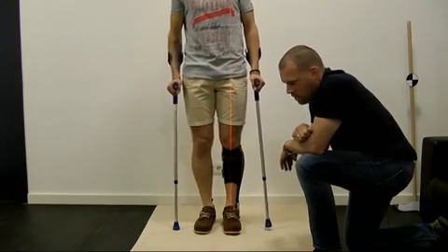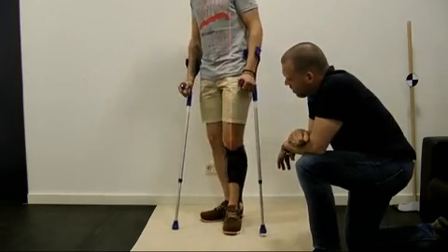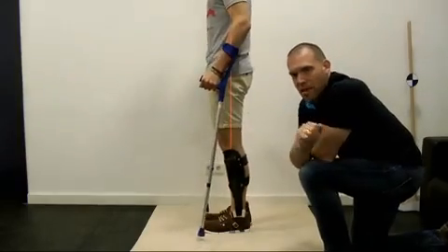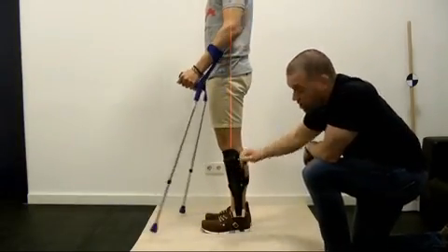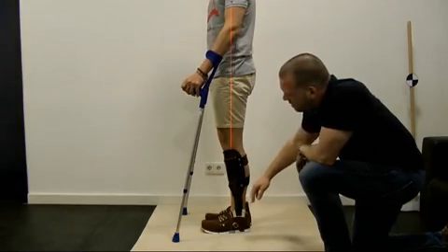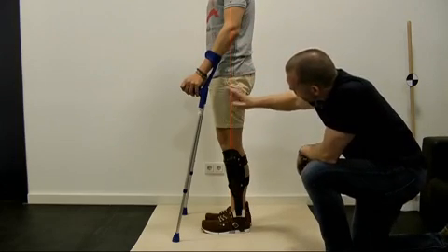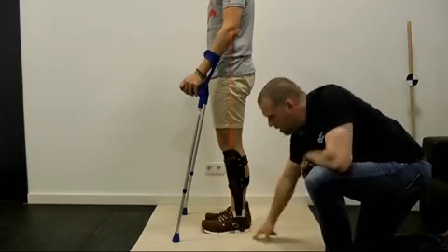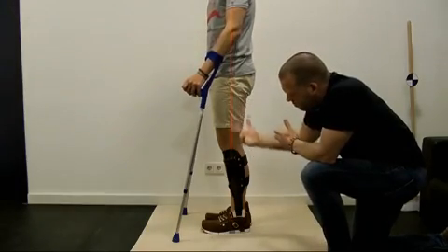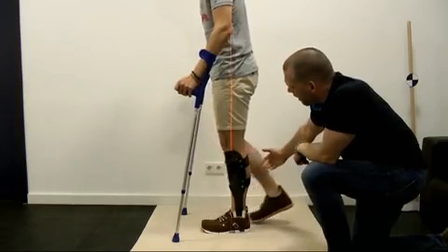If we now look at Henrik again from the side observing the sagittal plane, we can talk about what we were thinking of before starting the dynamic alignment of the NeuroSwing on the patient. Once again, why do we prefer this idealized alignment where the center of gravity line passes through the middle of the body, the hip, mid-AP at the knee, and the hatched area on the shoe? The reason is not only that balance is provided in standing, but also that a physiological position is achieved which corresponds to the position at mid-stance. Here it is shown by Henrik, comes very close as you see.